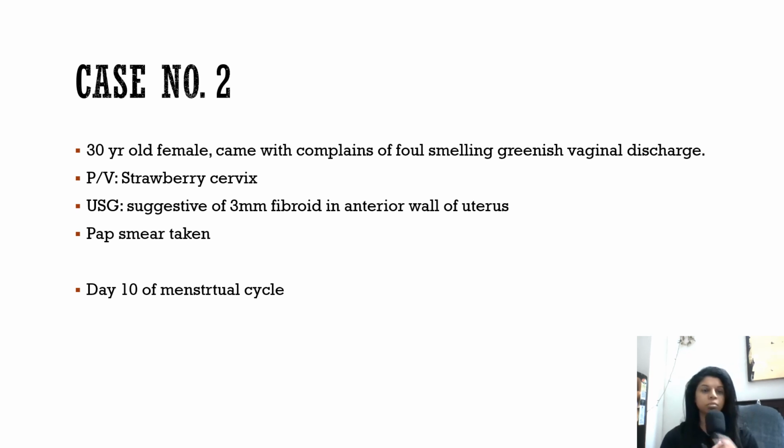Then we come to case number two. In case number two, it is a 30-year-old female who came with complaints of foul smelling greenish vaginal discharge. It is a very characteristic kind of description.